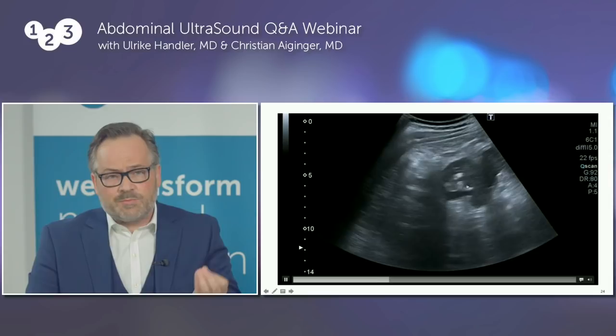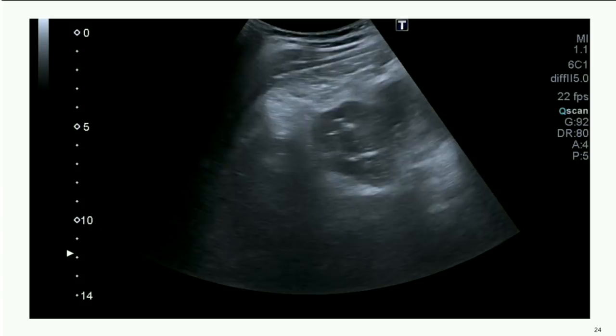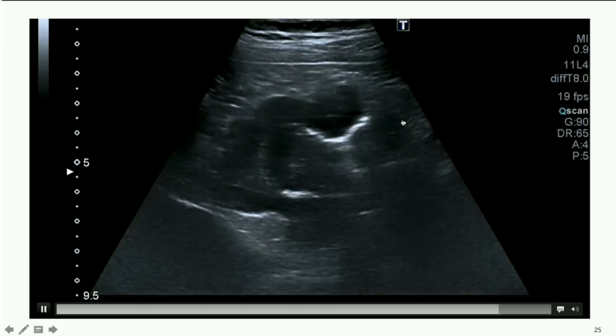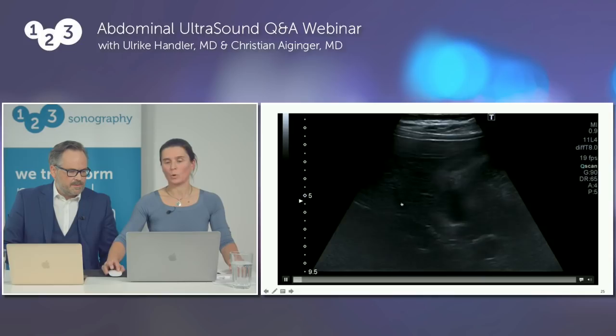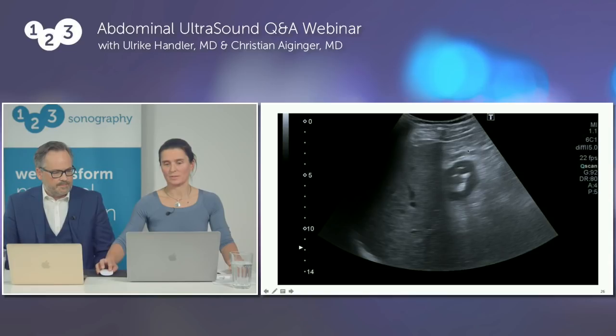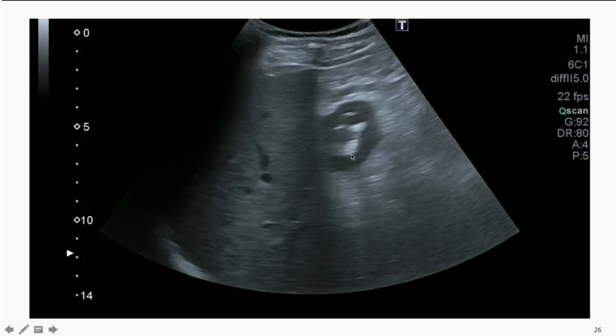We are in the right upper quadrant near the gallbladder, and one could mistake this for a kidney — that's why it's called the pseudokidney sign. This hypoechoic wall of the tumor, with the hyperechoic gas content inside, represents the right colon flexure and the right colon with this pseudokidney sign as a finding for a tumor.